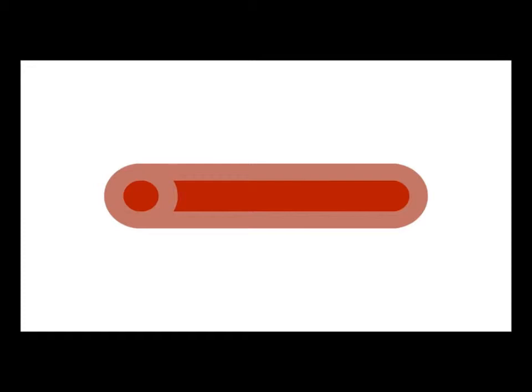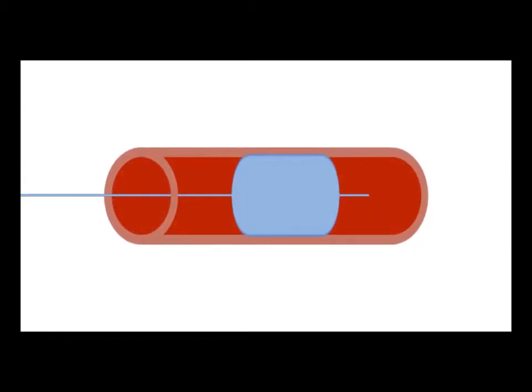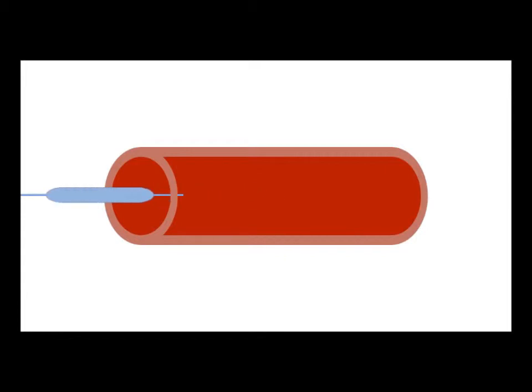Under general anesthetic, vascular access would be obtained typically using a femoral approach. A wire would then be carefully advanced under fluoroscopic guidance until it reached the target artery. After this, a balloon catheter would be advanced over a wire, and the balloon would be slowly inflated in order to restore the native vessel caliber. Endovascular pharmacologic treatment of vasospasm would occur in a similar fashion, except instead of using a balloon, a vasodilator would be injected directly into the catheter.